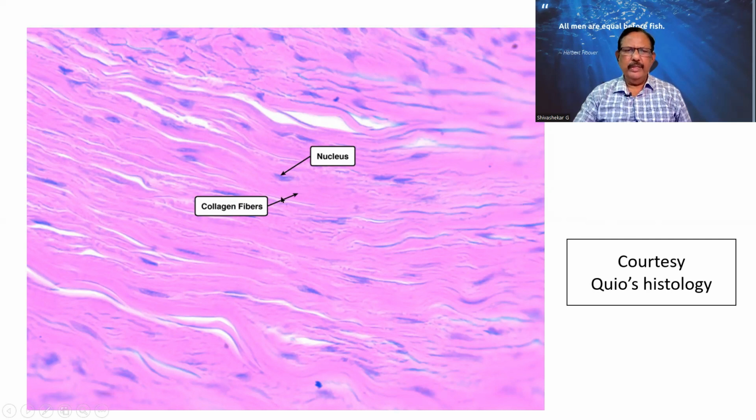Here is a nucleus, here is a collagen. Even the collagen will have a very sparse amount of nucleus. Fibroblasts will be elongated and long. So this is again fibrocollagenous tissue. More fibroblasts in this case, less over here. They are slightly irregular nuclei. Again fibroblasts. Here's histology, a beautiful source you should not miss.